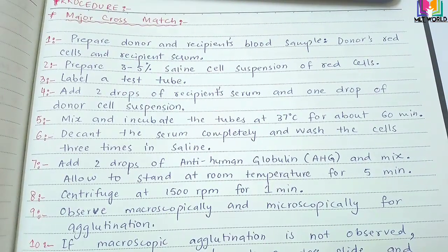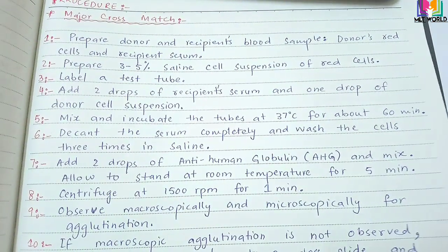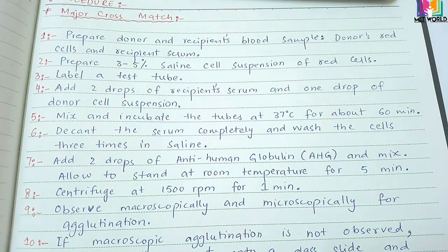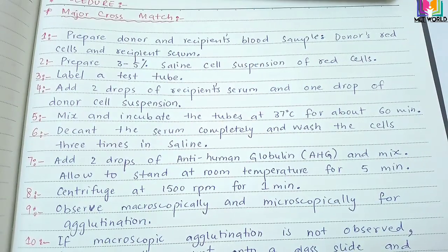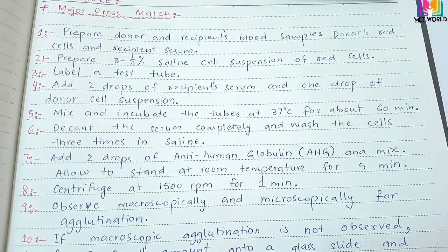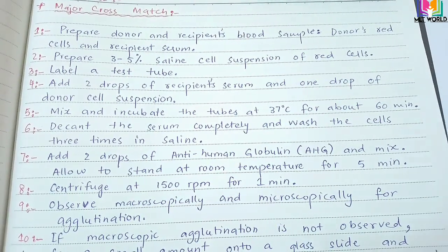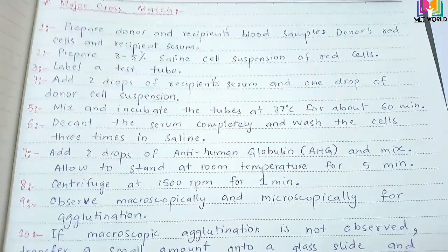Now first we will see the procedure of major cross match. First of all, we have to prepare the blood samples of donor and recipient. As I told before, in major cross match we will take donor red cells and recipient serum. Red cell means red blood cells. Now from donor red blood cells, first of all we will prepare a 3 to 5% saline cell suspension. After that we will move toward the procedure. So basically you need donor red blood cells, that is a 3 to 5% suspension, and from the recipient you need serum.